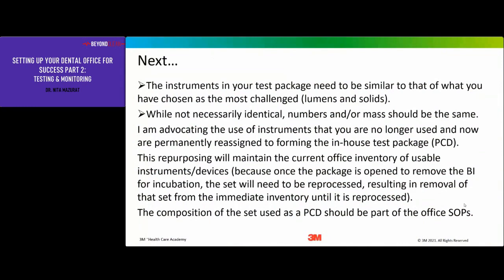I advocate that they're non-functional instruments, broken, for example, no longer used, and now permanently reassigned to forming that package, so that you always use the same package over and over. It just makes life much simpler for you, I think. By repurposing those non-functional instruments, it maintains your current office inventory. I think dental offices often suffer from having a poor or low inventory, so when we repurpose those non-functional instruments for this purpose, we're not further reducing our current inventory.